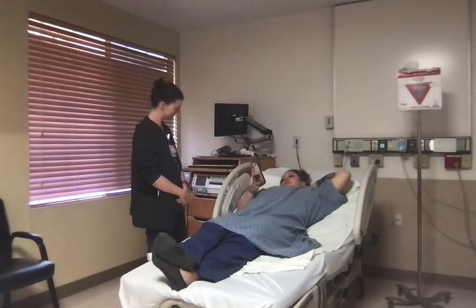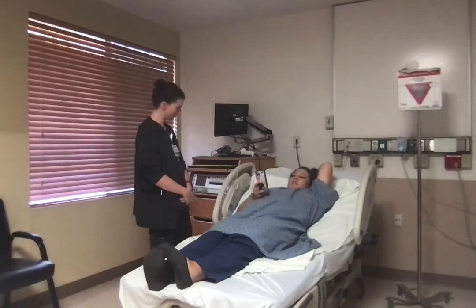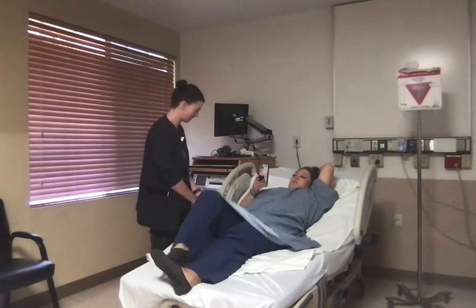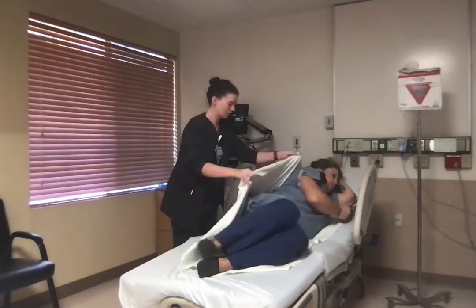I'm feeling much better now, thank you. The epidural helped. I don't have any pain. I'm happy to hear that you don't have any pain. Baby's heart rate is going down a little bit though, and I did want to reposition you to help get that back up where it needs to be. Okay, is he okay? Is everything fine? He is. He's doing good.